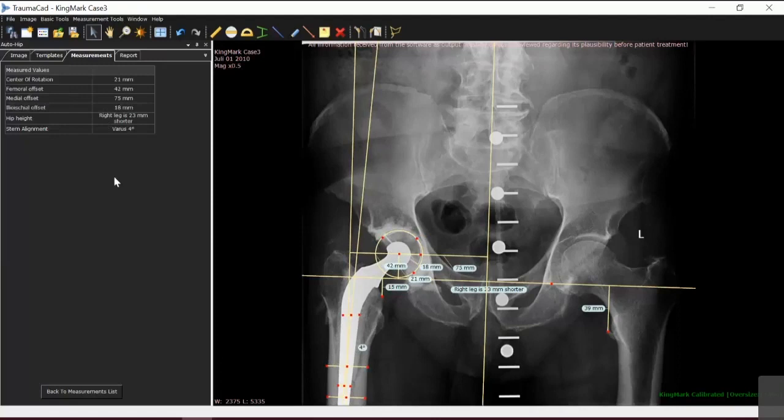Over and above this, there are certain things that I can't mention in this call, but we are working with a group of surgeons who are looking at many thousands of post-operative cases, not only for hip arthroplasty or revisions, but also for trauma, to be able to identify from the image what implant had been implanted 10, 15 years ago.